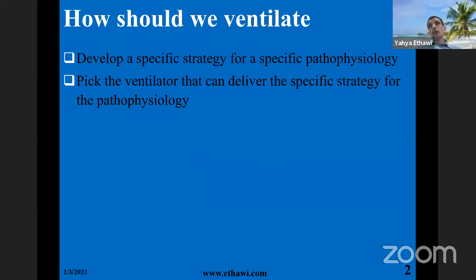So when you buy, order or deal with a ventilator, you have to know whether that ventilator can deal with that pathology or not. Therefore, you always need to select, for example in neonatology, neonatology designated ventilators.